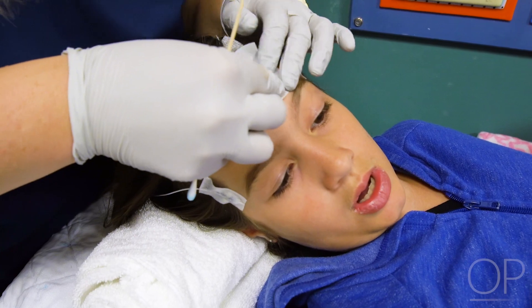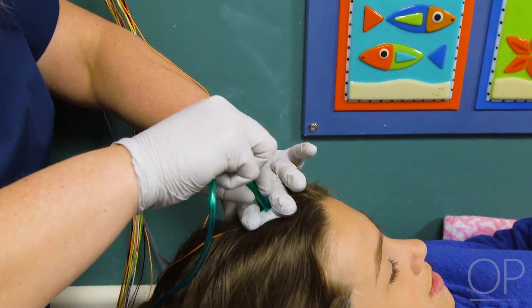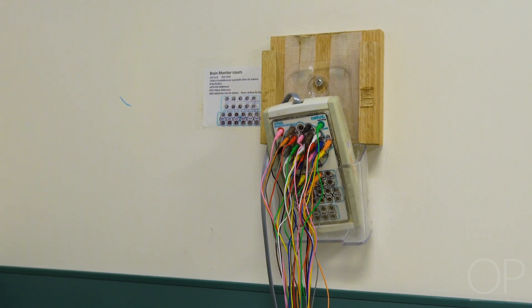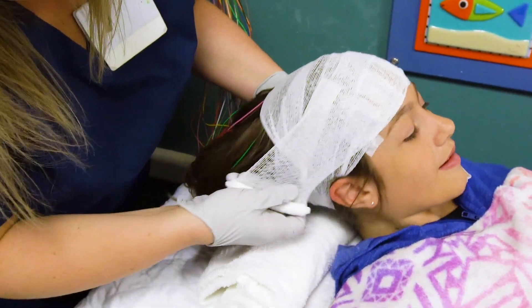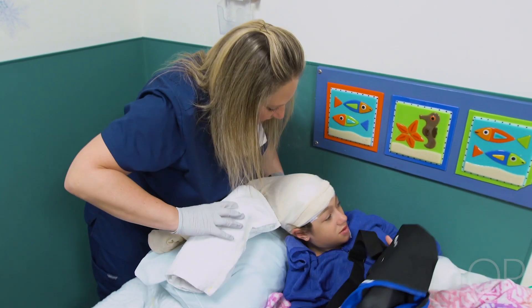This glue can have a funny smell and it feels cold and wet. After each sticker goes on, a tube blows cool air to dry the glue. The electrodes are connected to the EEG machine with rainbow colored strings — this machine records your brain waves. You may get a special hat to wear over the strings.